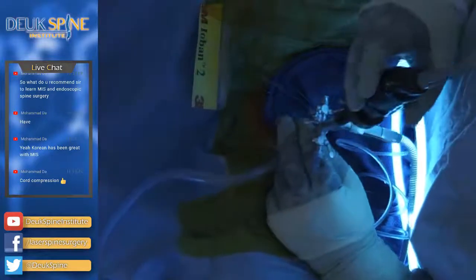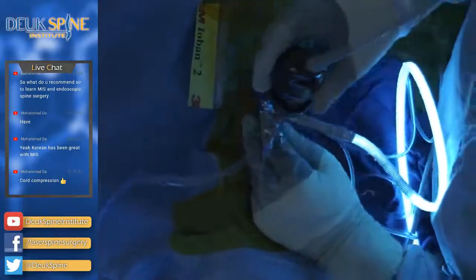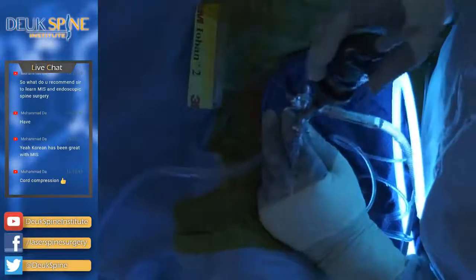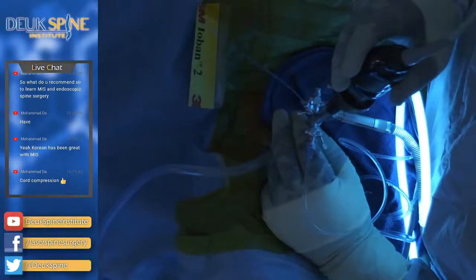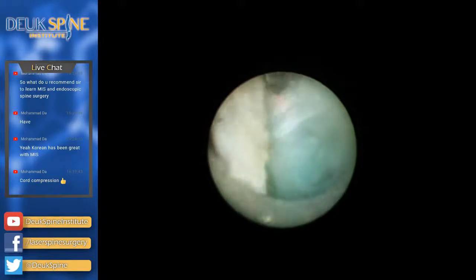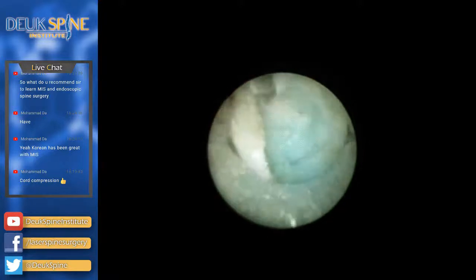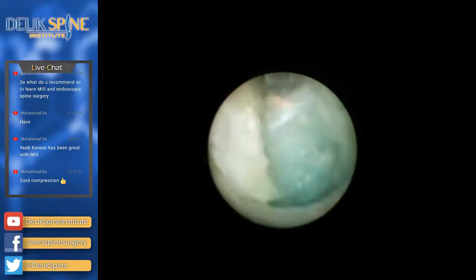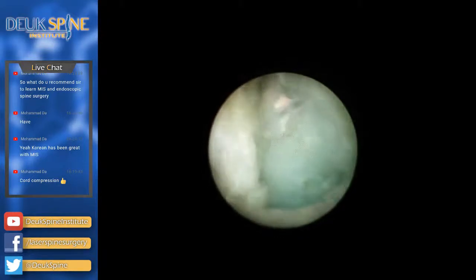I'm going to have to cut some more of these fibers. There's another herniation, a reverse herniation, coming from right on top of the spinal cord, folks. Literally sitting on the spinal cord. And the only thing keeping it there are these last few fibers of the posterior longitudinal ligament. Oh, yeah, we're going to get a rupture. It's like a zit popping. It's about to come. Here it is. Come on now. I know you want to get out of there. It's tethered down. It's so cool.